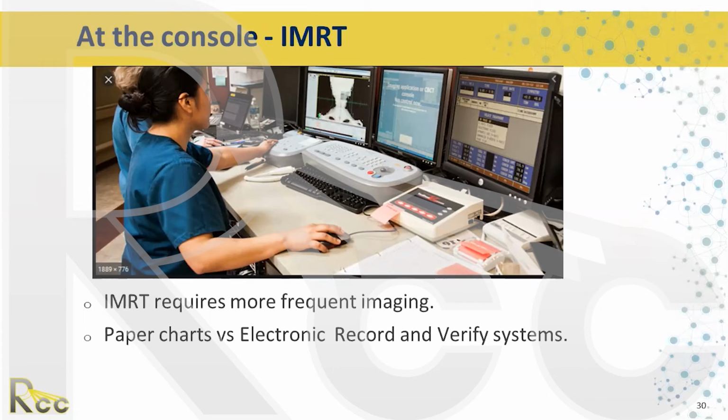You want to make sure that you're always watching the patient during treatment. And the second therapist needs to be documenting everything, like recording your timeout, making sure that the first therapist is paying attention. But again, you're also going to check your entire plan, which I think we're going to be talking about in the next slide. They just say to talk about electronic charting.